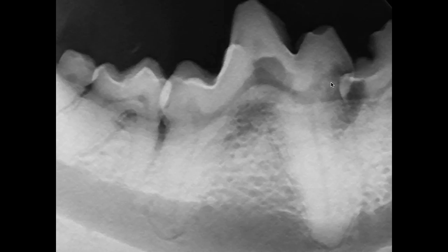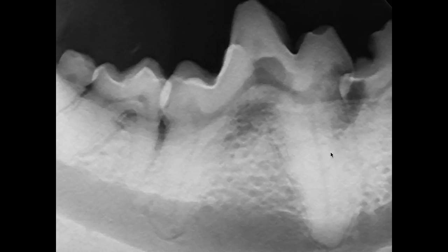This is a case for extraction, but it's not going to be an easy extraction. You don't have a thin periodontal ligament space around this portion of the tooth. So when you see that, you're approaching ankylosis in this area — that's not an easy extraction.